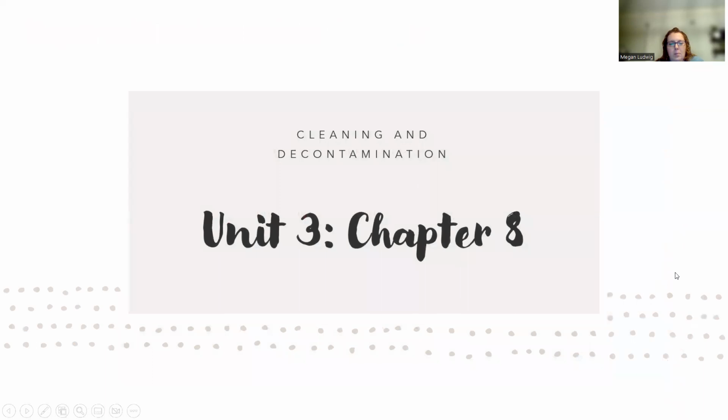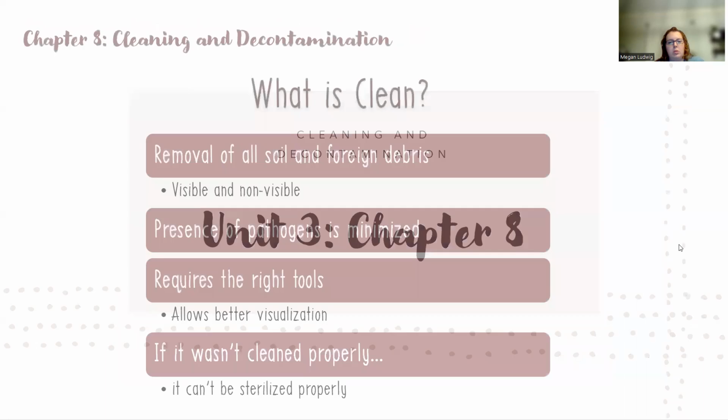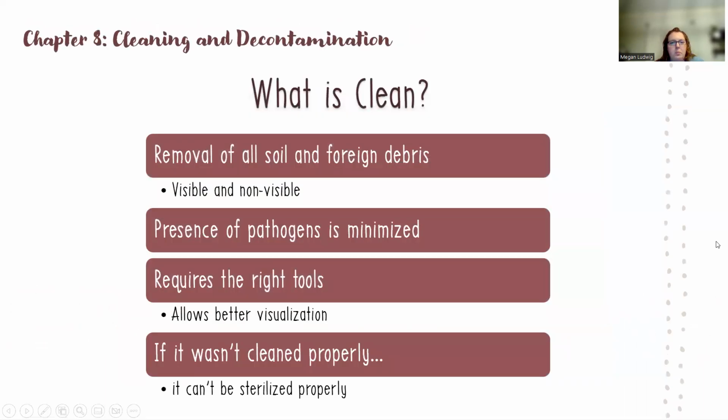All right, so let's talk a little bit about chapter 8, which is cleaning and decontamination. A lot of important info in this chapter that you need to read through. First of all, what's the definition of clean? It's not the same as sterilization. We talked about that earlier.